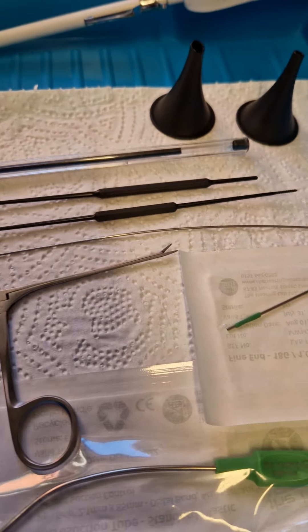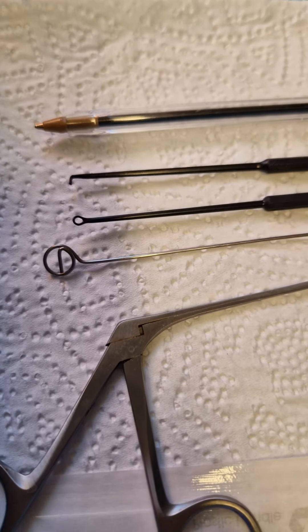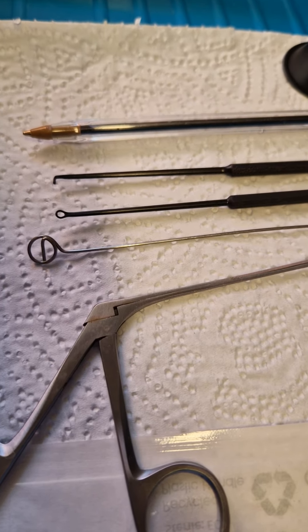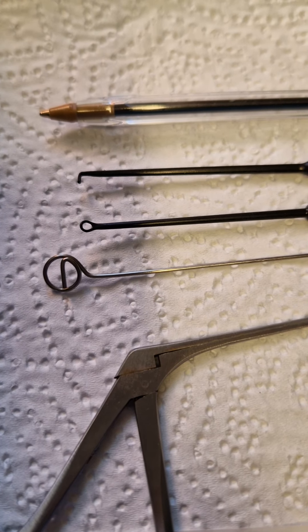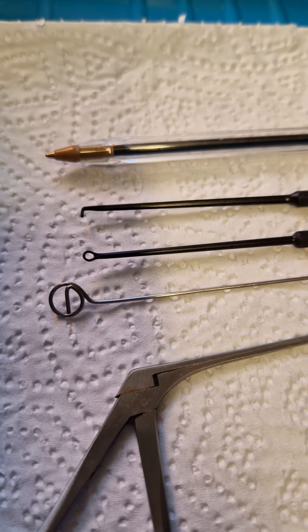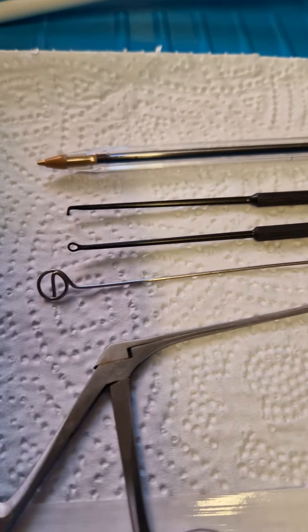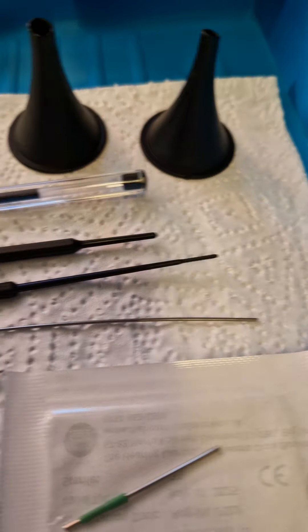I've put a pen here so you can get some perspective on how tiny these things are. The first one is the ear hook — the Barts hook as it's commonly known — really good for very dry wax that you just can't get a good grip of with the suction tube. Then you've got the infamous Jobson horn, which is tiny, and that's good towards the outer aspect of the ear if you're trying to scrape some dead skin away or scoop out particularly troublesome wax.